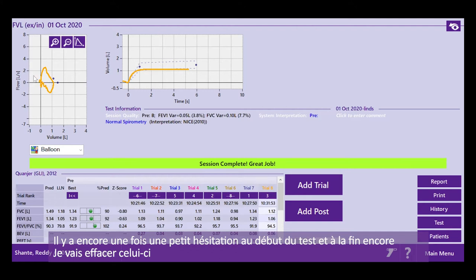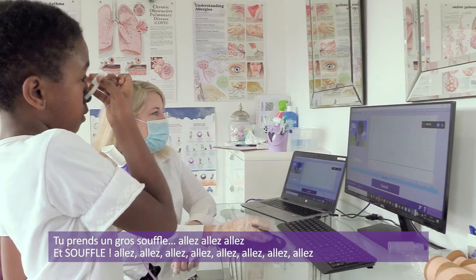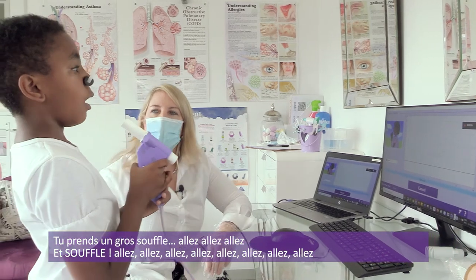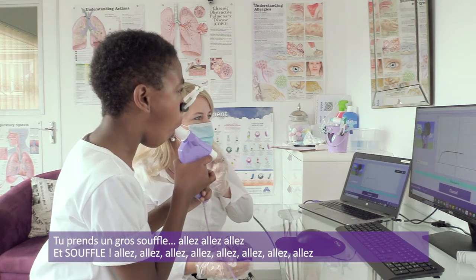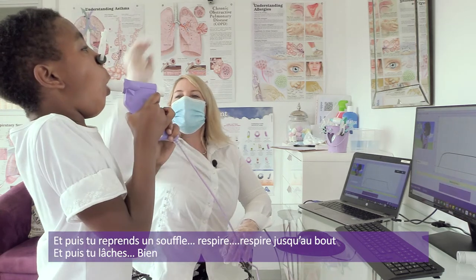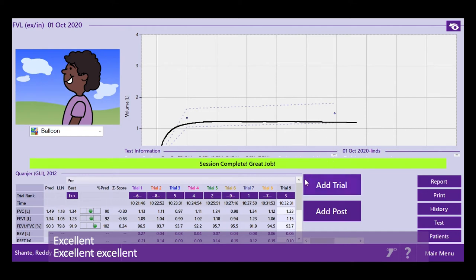Okay, there was just a little hesitation again at the start of the test and towards the end of the test again. I'm going to delete that one. All right. Okay. Let's take a deep breath in all the way to the top, fast as you can, into the top and and breathe in. Take it out your mouth. Good. Well done. Excellent.